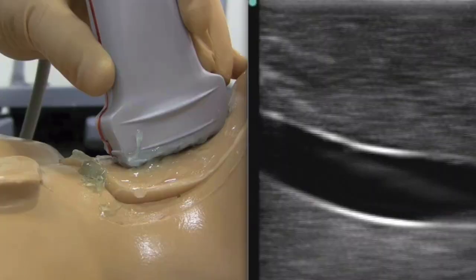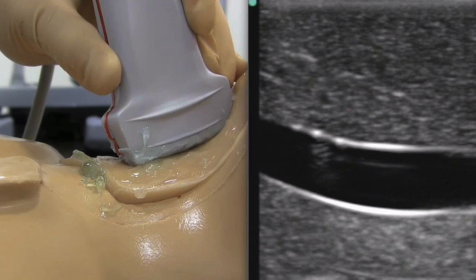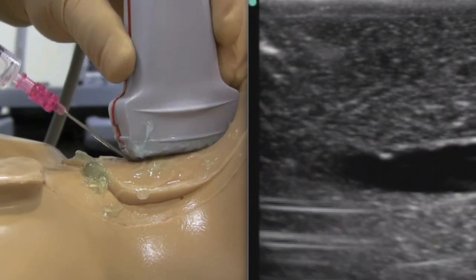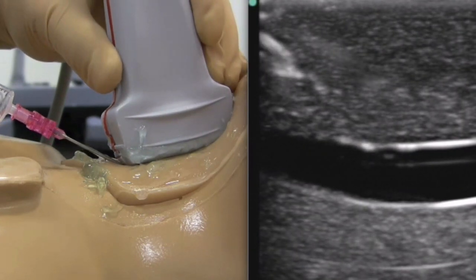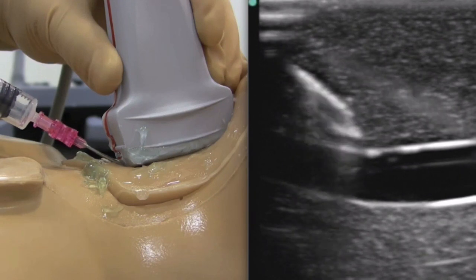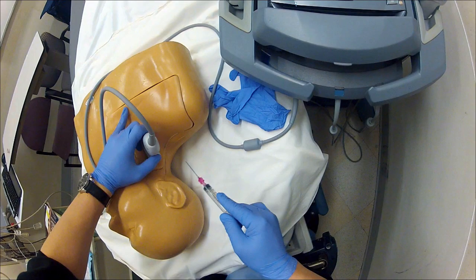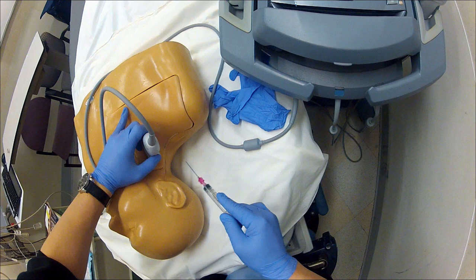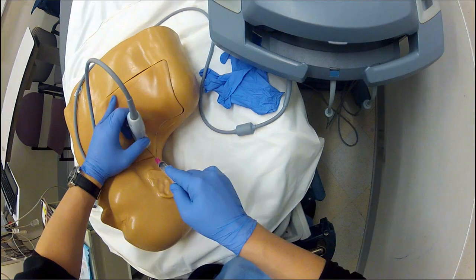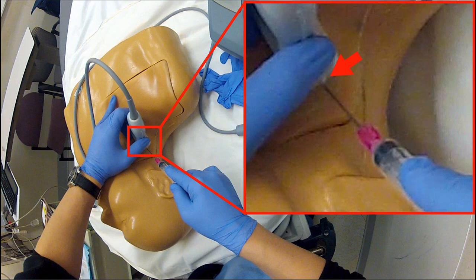A lift technique can help you align the needle with the probe. The seam of the probe is outlined in the center, and you rock the probe up slightly, giving you easier access to align the needle with that seam. This clears your view of the needle tip. When the needle tip is within the tissue, make sure you have a clear view of the needle tip before advancing — do not advance the needle to gain a view. The lift also provides a little extra space to access and clearly exposes the probe seam for alignment.